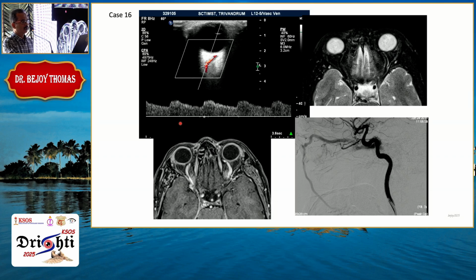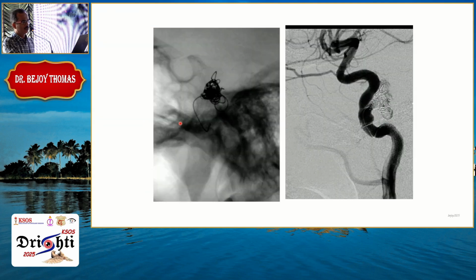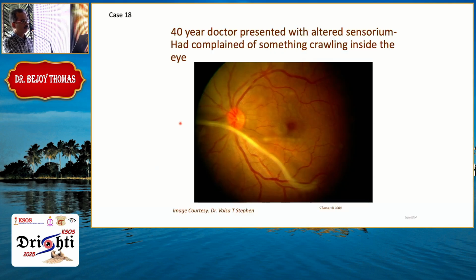And this is carotid cavernous fistula. We have seen the different subtypes, and you can diagnose it very easily with an arterialization of the superior ophthalmic vein, and we can do the embolization as previously mentioned. This is a very gratifying thing for interventional radiologists. Only interventional neuroradiologists can treat this. No surgery can be done, and no medical treatment can cure the patient. So this is the last case.